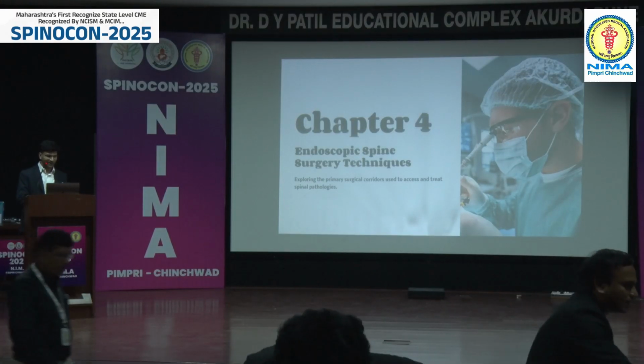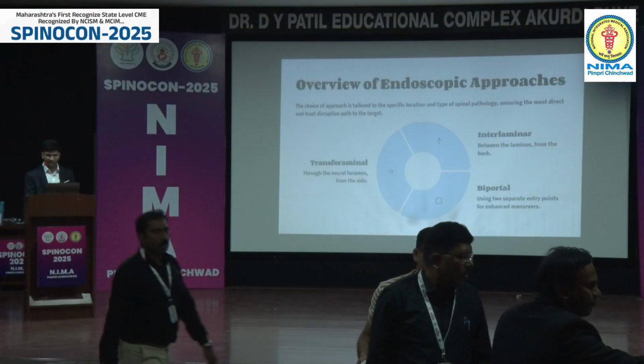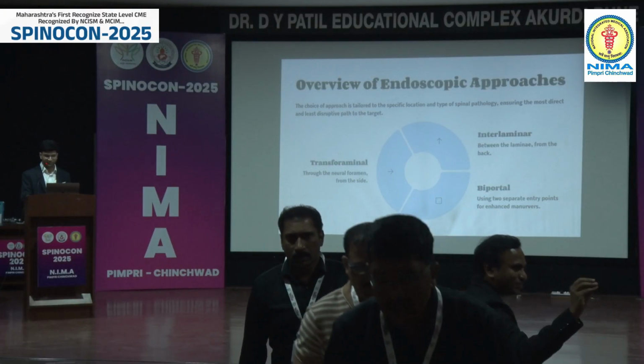In chapter 4, we will understand the endoscopic spine surgery techniques. Basically, there are 3 techniques. One is transforaminal, second is interlaminar, and third is biportal.